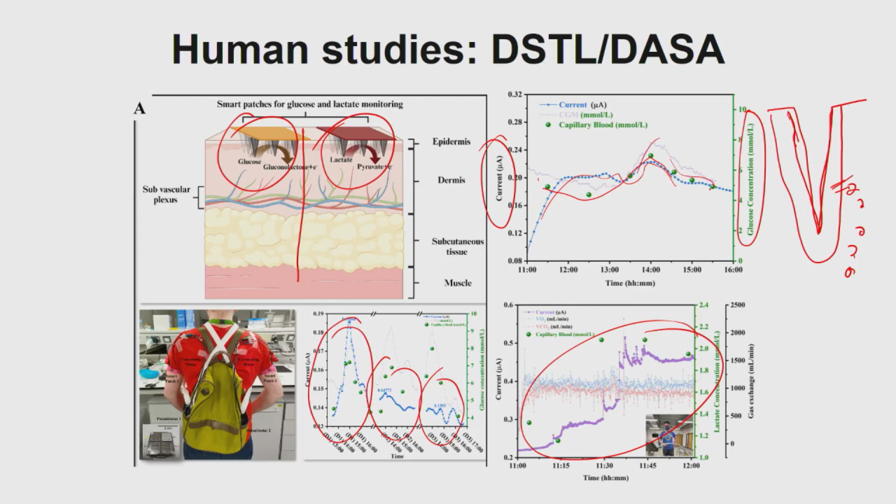So all looks very good, and you're getting data. As I said, what is important for us is these postprandial events, where you can capture the events, because we are measuring current, and then you have to correlate the current to the glucose values. And for that, there is an existing technology which is called factory calibration.